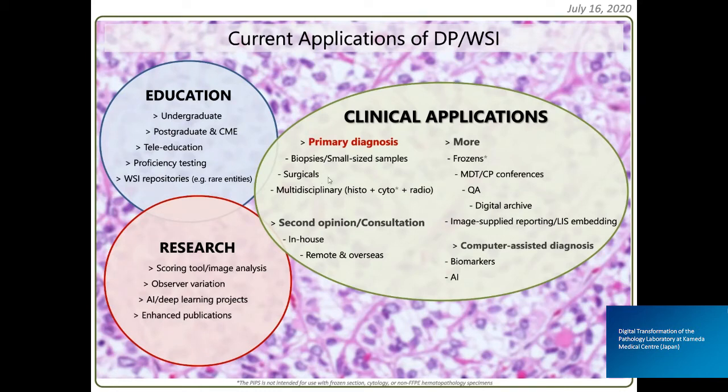Clinical applications of digital pathology themselves also span from primary diagnosis to second opinion or consultation, and more activities like making a digital archive, quality assurance, and what got recent recognition, computer-assisted diagnosis, like image analysis and artificial intelligence.